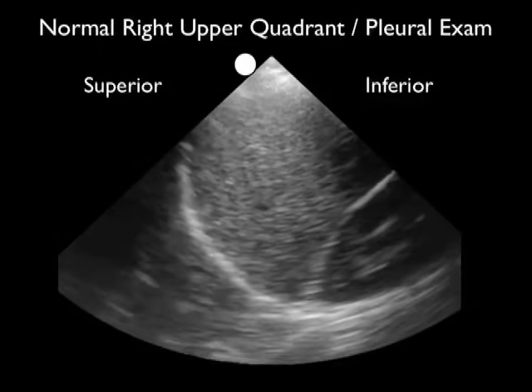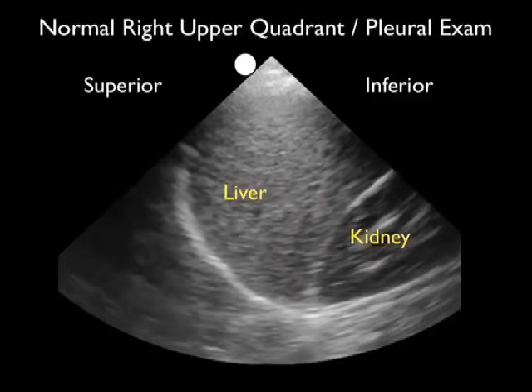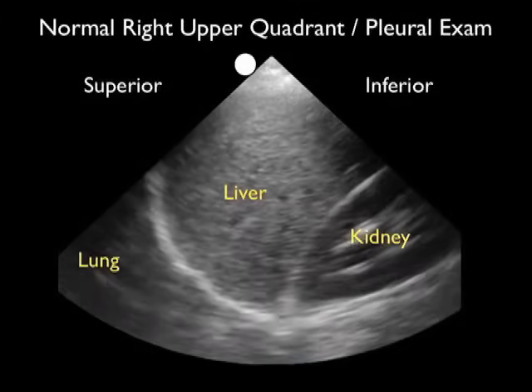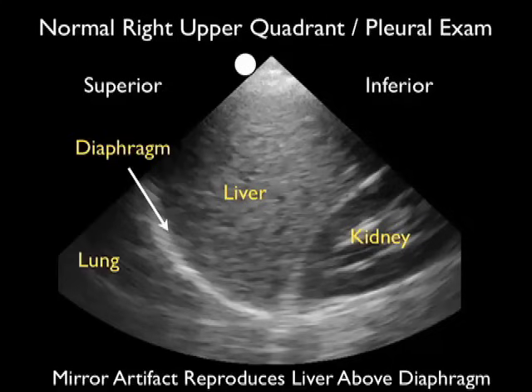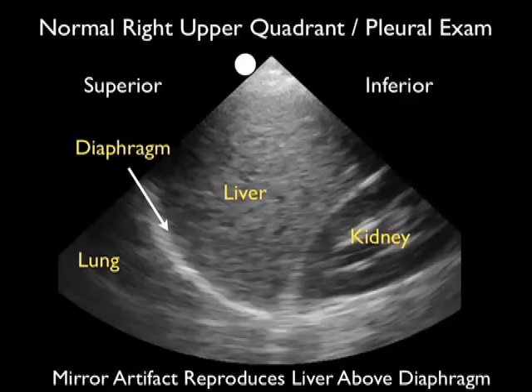Now let's take a look at a normal right upper quadrant pleural examination. The probe is configured in a long axis orientation with the marker towards the patient's head, so superior is to the left and inferior to the right. The liver is in the middle of the image. Above the liver we see the diaphragm, that curving white line which is moving up and down as the patient breathes. Superior to the diaphragm is the thoracic cavity. What we see there is something called mirror artifact — this occurs as sound waves pass through the diaphragm and reproduce what looks like a mirror image of the liver within the chest. This is a normal appearance, and notice the absence of a dark or anechoic fluid collection within the right chest.